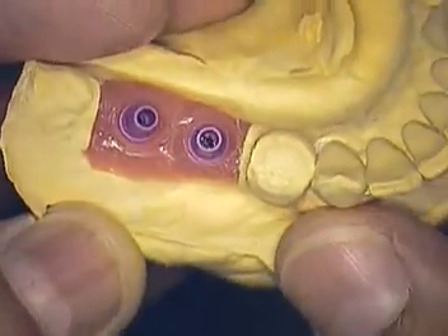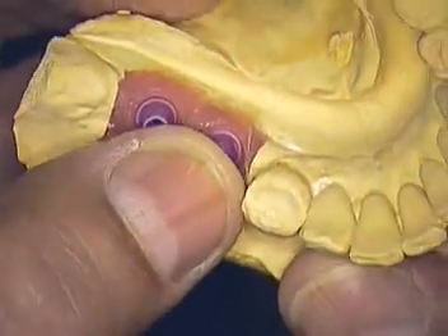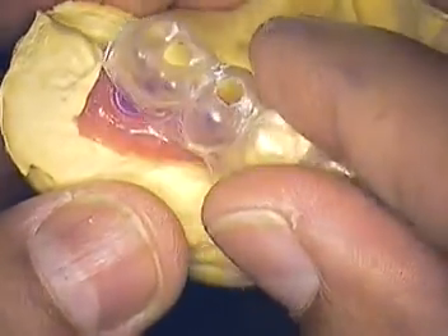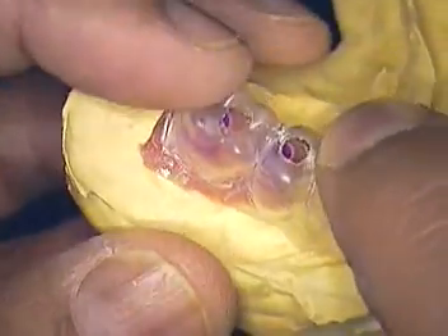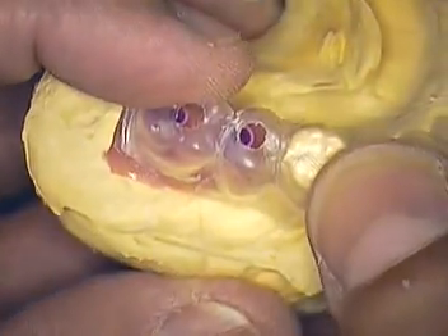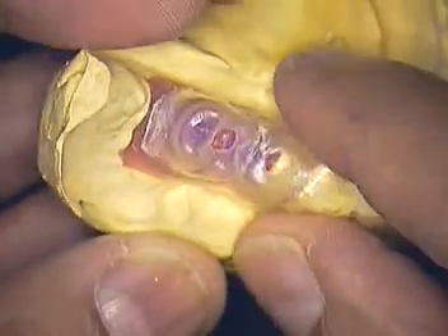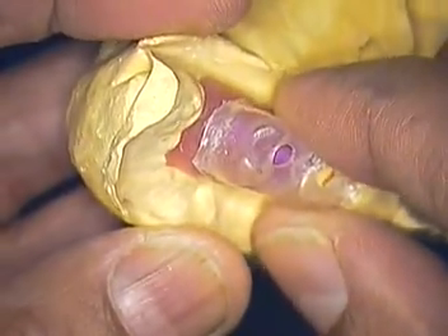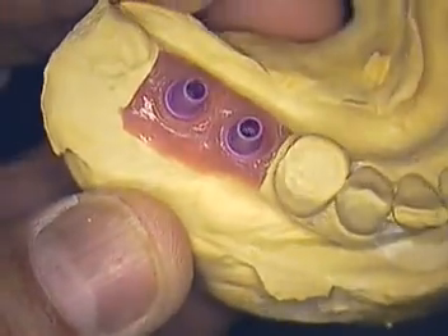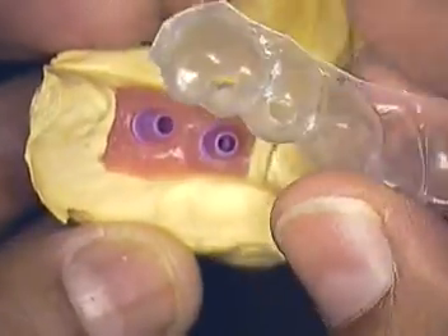For you restorative dentists out there, you can see you have your options certainly. Try to get with your surgeon before the case is started. Wax it up, work it out, tell them where you want it. But this happened to be just the opposite — the surgeon had the case and went ahead and placed the two implants without the surgical guide. So do your homework first.